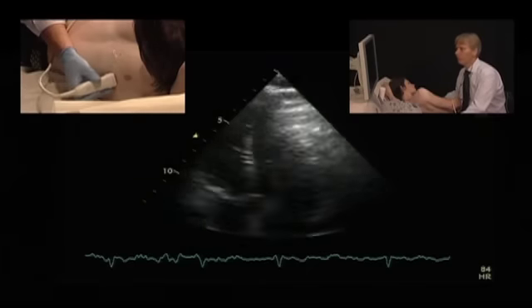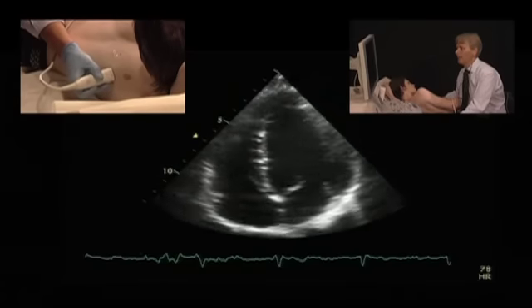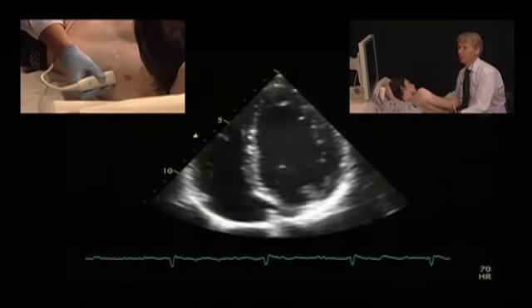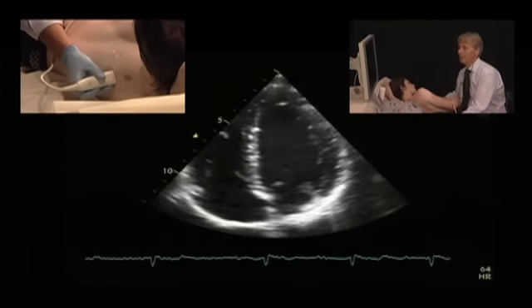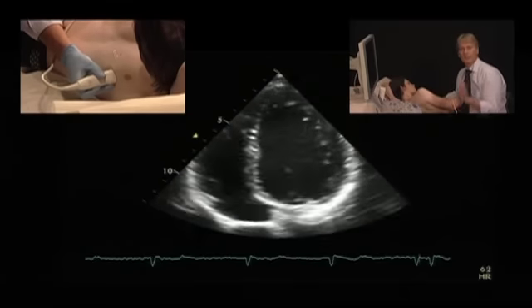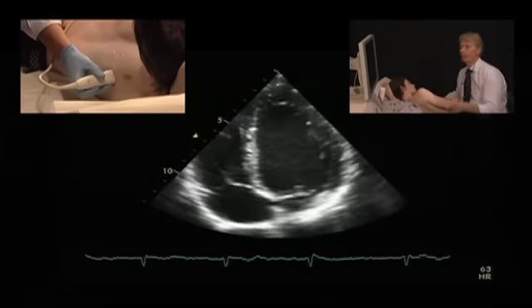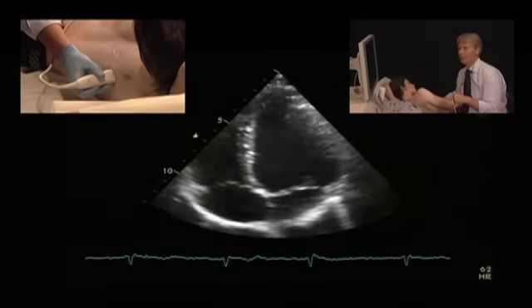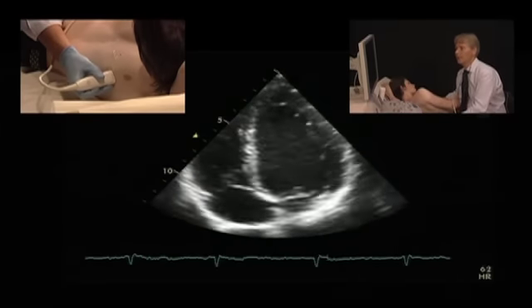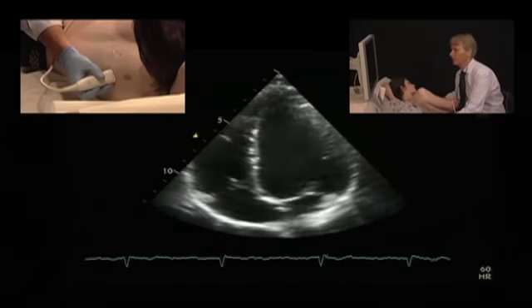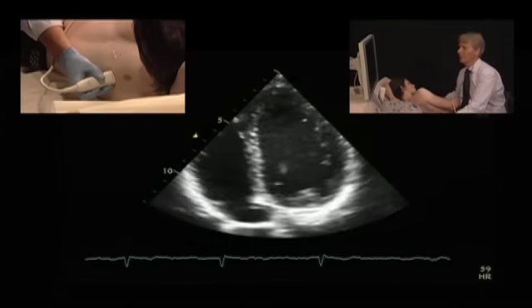The easiest way to get to a two-chamber view is when you start out from a four-chamber view. But before you rotate, before you try to get there, the most important thing is that you have to try to get the ventricle right in the middle. Because when we rotate, we will be rotating around that middle. And if you do not put the left ventricle in the middle, you will be rotating around different structures and not the left ventricle.